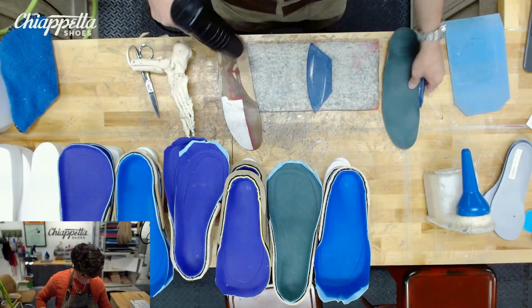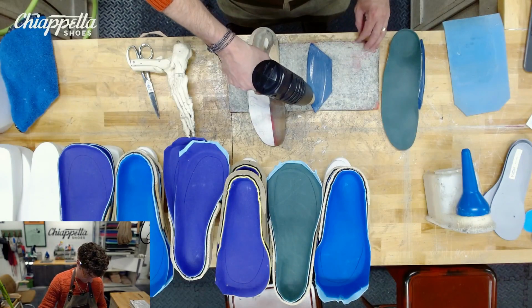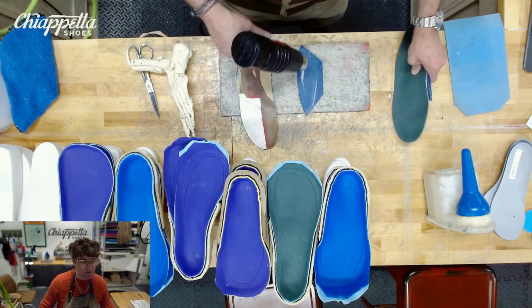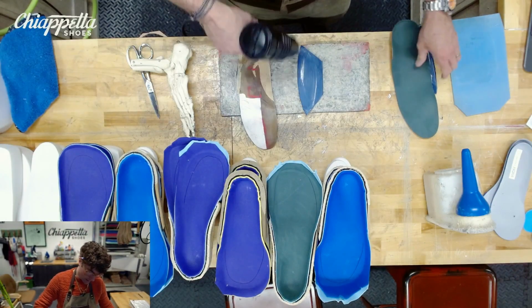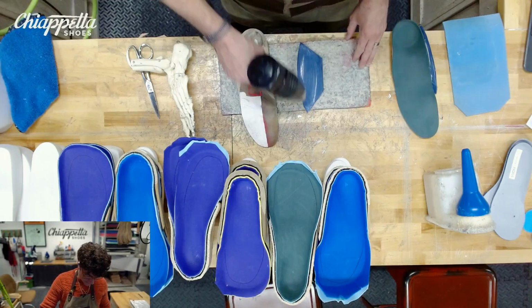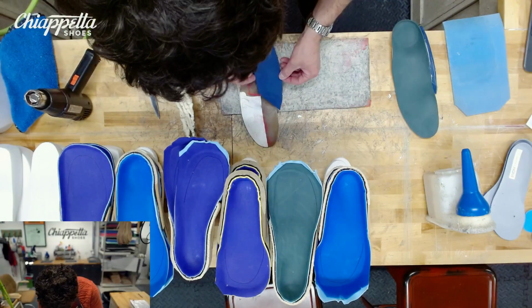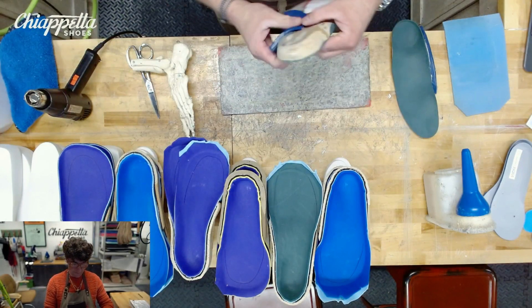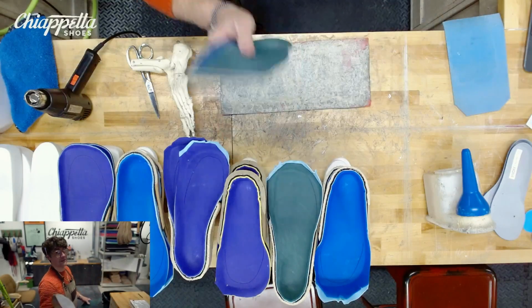Get this one. And typically, most EVAs you're going to heat up in an oven at 350 for anywhere between 30 to 60 seconds, depending on thickness and durometer. With a 45 durometer under a heat gun, I'd probably do it for about 60 seconds. Make sure you're spreading it out nice and even. And it gets hot, so you gotta be careful. All right. Perfect. Take these to the grinder and then get the pour on that.